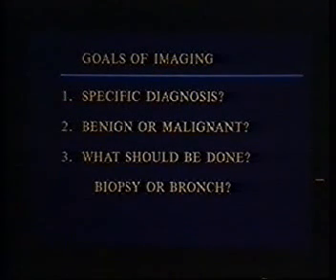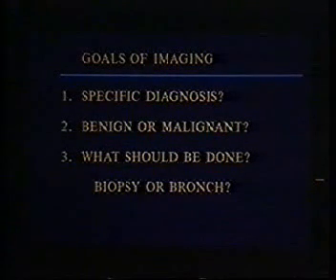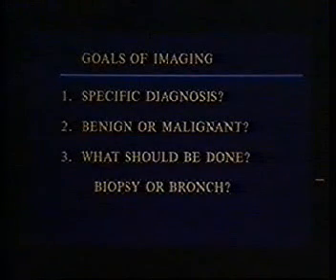If we can't do that, the next thing we try to do is decide whether it's benign or malignant without making a specific diagnosis. And if we can't do that, then we perhaps try to decide on the basis of our imaging studies what should be done, either needle biopsy or bronchoscopy, and we will call Dr. Westcott for that.